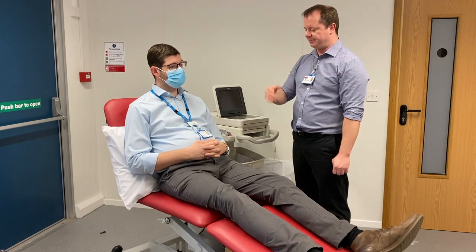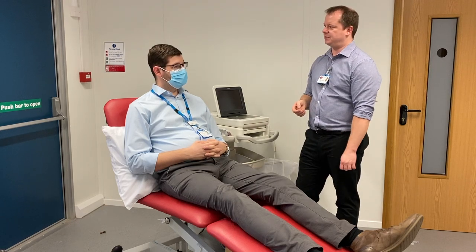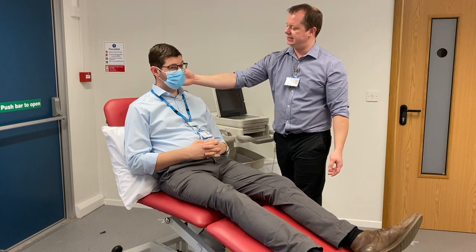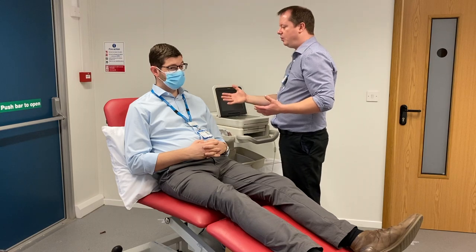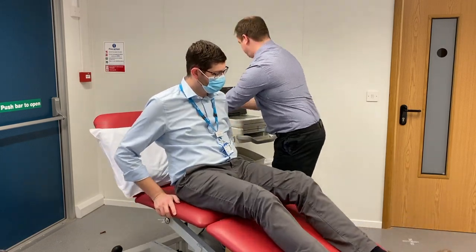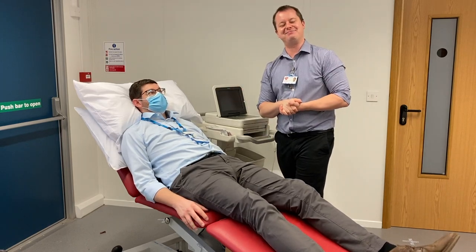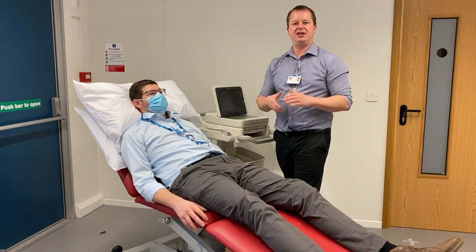Once we've checked our patient's details and know what we're doing, we need to get the patient in a good, comfortable position. James looks relatively comfortable, but we're looking at electrical activity of muscle — the muscles in his neck are all engaged trying to keep his head up. So we need to make sure he's in a truly comfortable position. James is quite tall, so I'd ask him to scoot down, lower the back of the bed a touch, and add more pillows so his head feels supported. Once he's more relaxed, he can relax all his muscles and we'll get a clear picture.